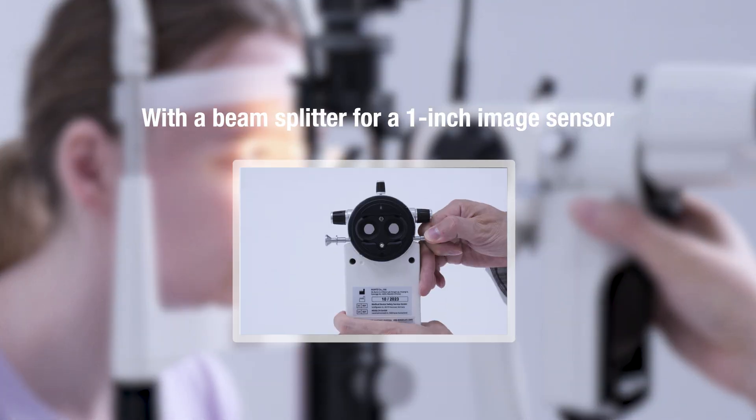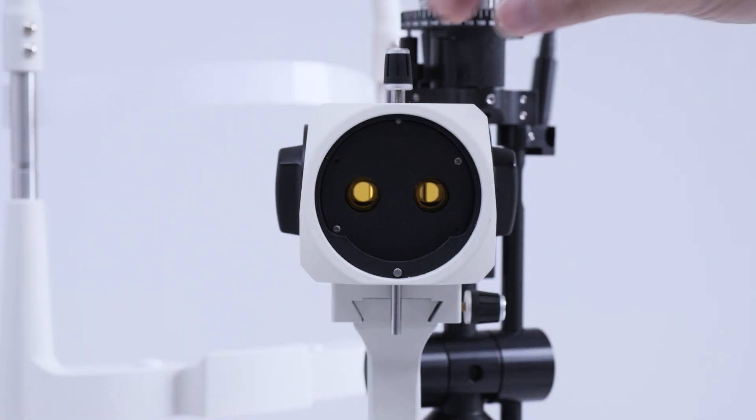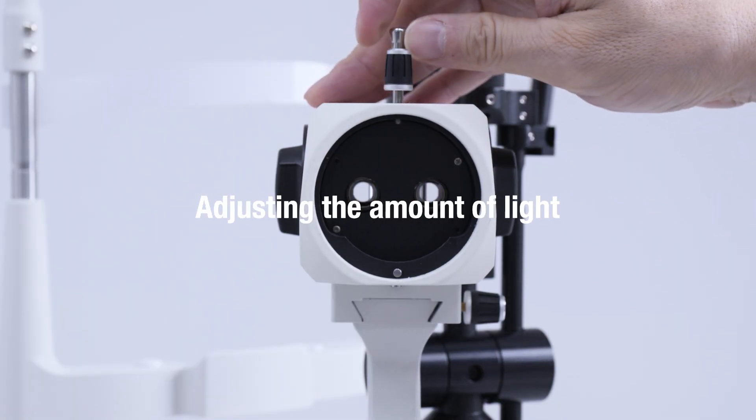By adjusting the amount of light with a beam splitter for a 1 inch image sensor, you can see more brightly with your eyes.